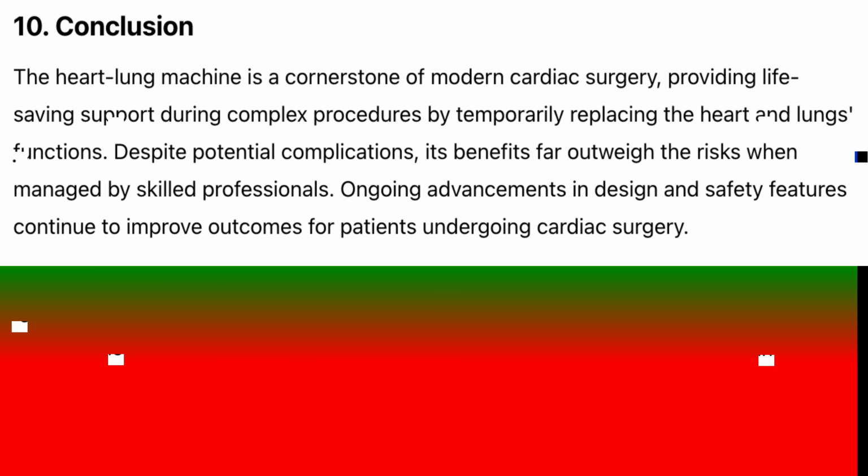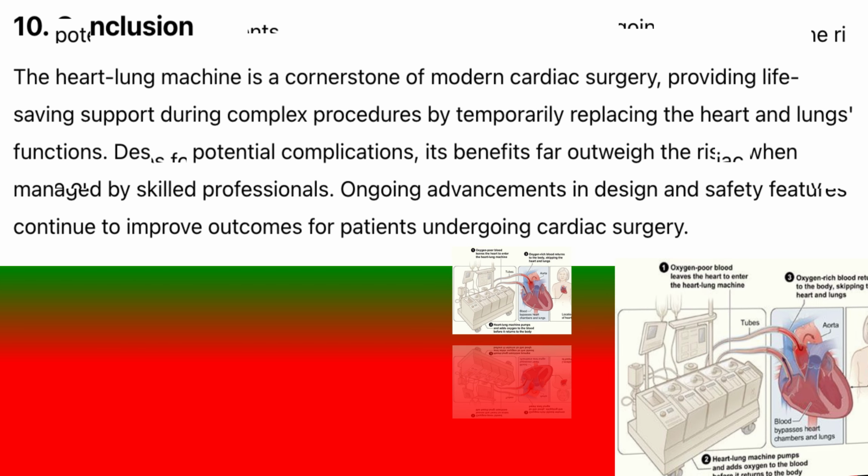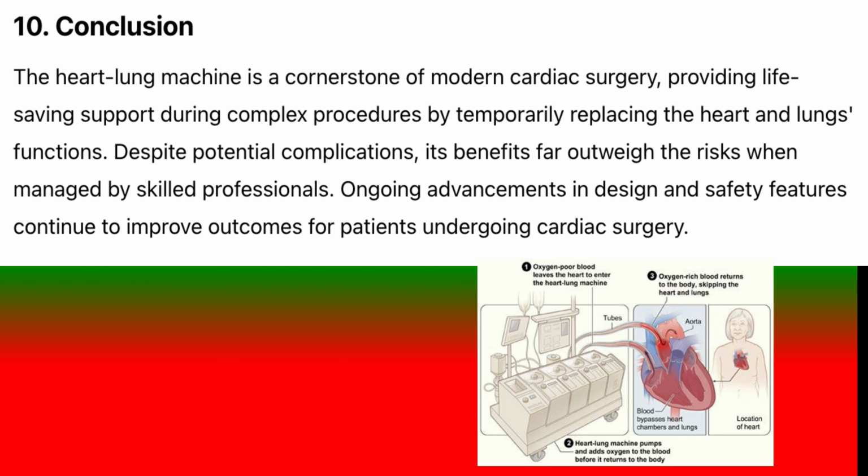10. Conclusion. The heart-lung machine is a cornerstone of modern cardiac surgery, providing life-saving support during complex procedures by temporarily replacing the heart and lungs' functions. Despite potential complications, its benefits far outweigh the risks when managed by skilled professionals. Ongoing advancements in design and safety features continue to improve outcomes for patients undergoing cardiac surgery.